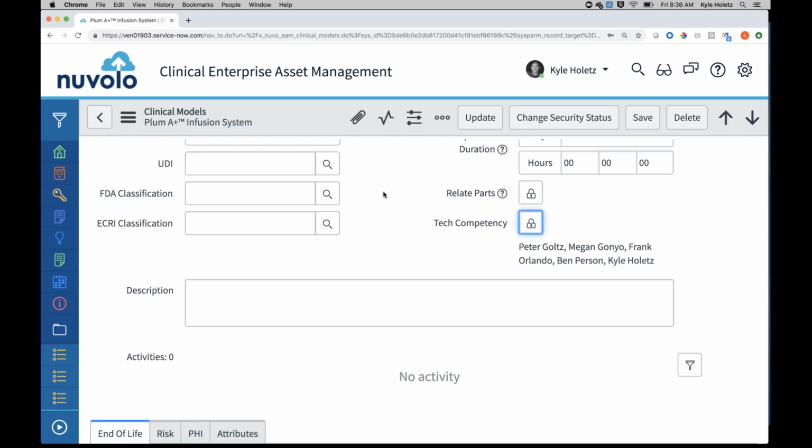And we can also flag on a work order if a work order's been open within the last X amount of time, so we can be notified of that as well. If a corrective comes in right after another corrective on the same device, we get notifications around that to address it. And there's a couple questions in the back I want to get to as well.